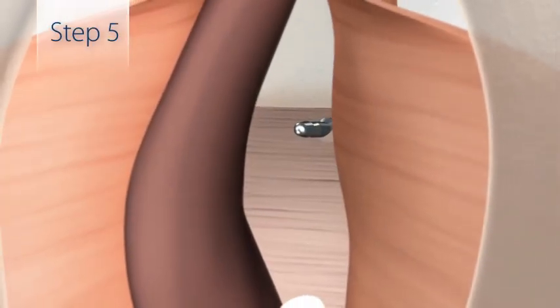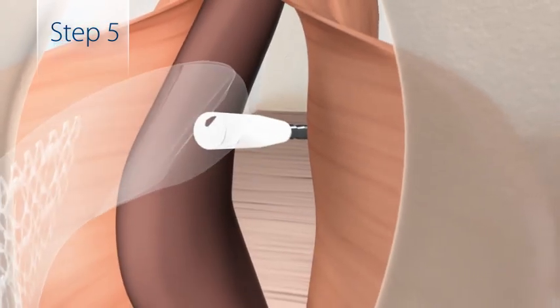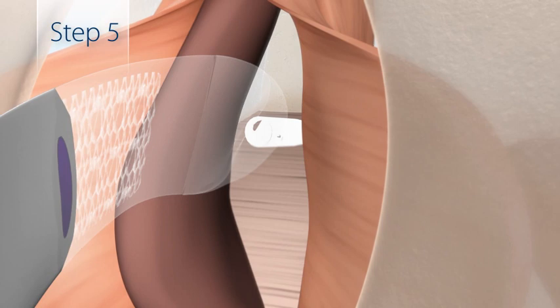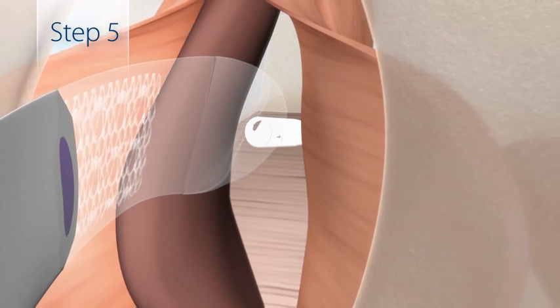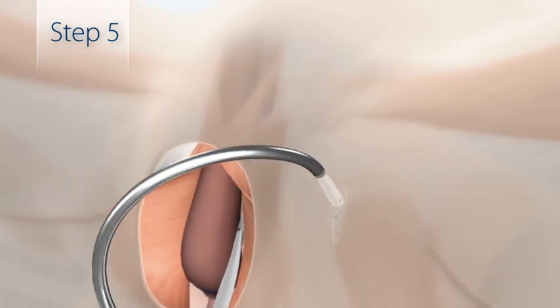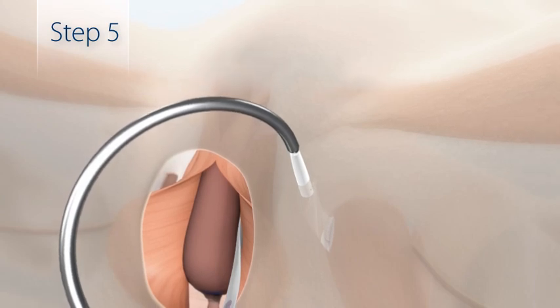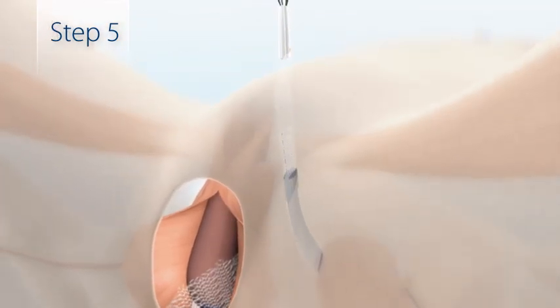After passing the needle, connect the sling by pressing the white connector onto the needle tip until it clicks into place. Make sure the blue dot is facing away from the urethra. Once connected, draw the sling out the stab incision by rotating the needle back along the insertion pathway. Pull only enough to bring the center of the sling to the patient's midline.